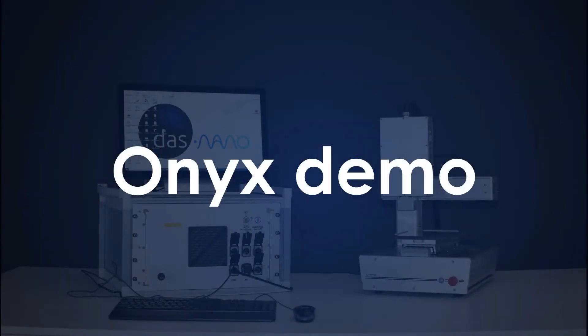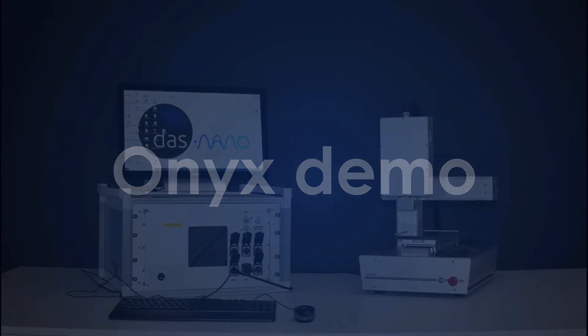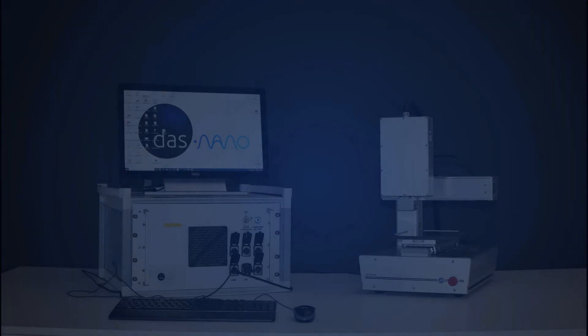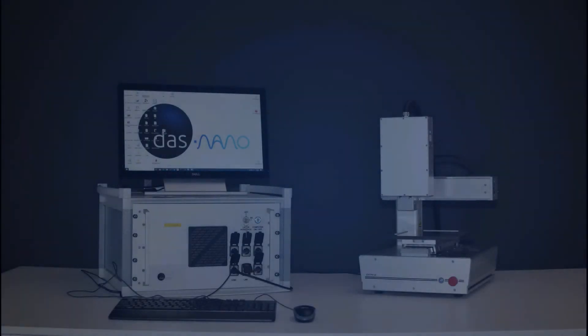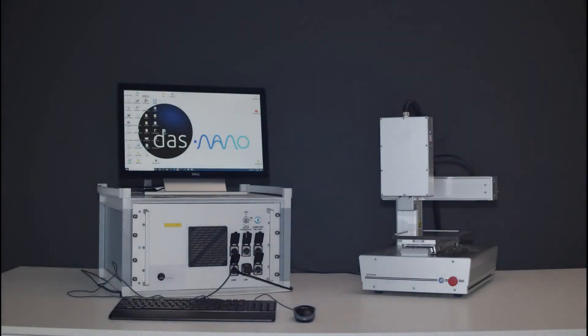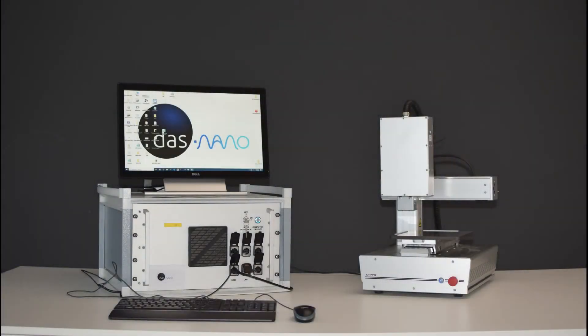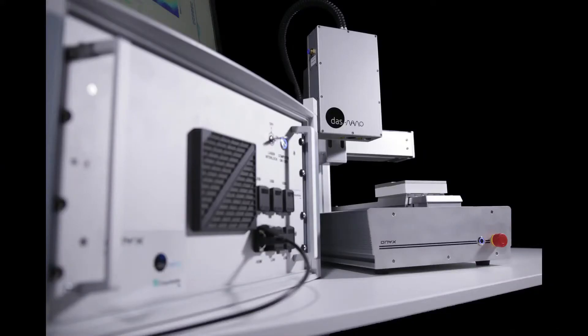We will now start a short demo of the ONIX tool. We will characterize a bare quartz substrate sample and a P-dot sample over quartz substrate.